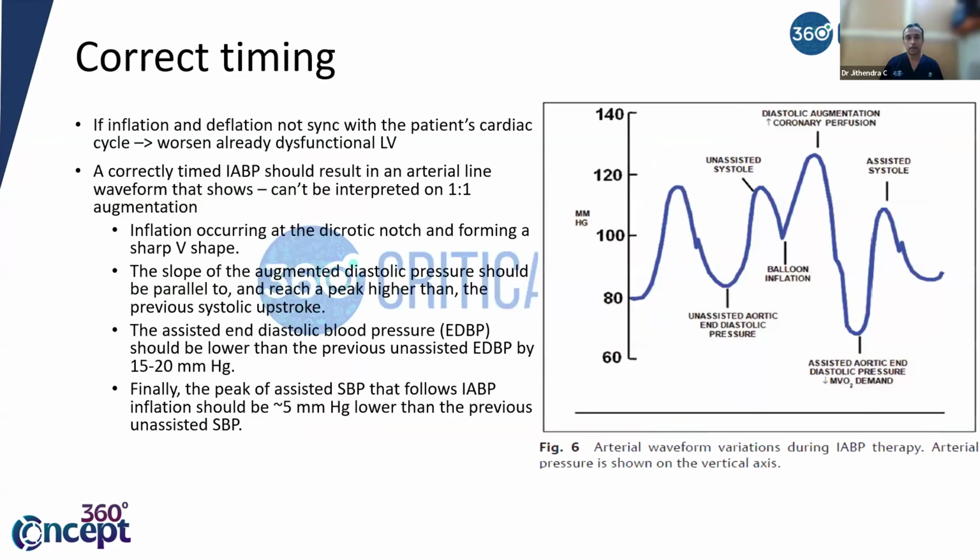Okay. Now coming to the next part. We have discussed the theory part. Now we'll go into the commonly asked questions. I told you the commonest questions which are asked about IABP are timing of your inflation and deflation. I've already repeated this in the previous slides, and I'll be reinforcing it here.